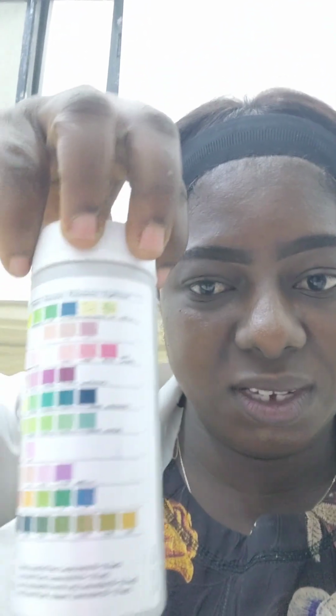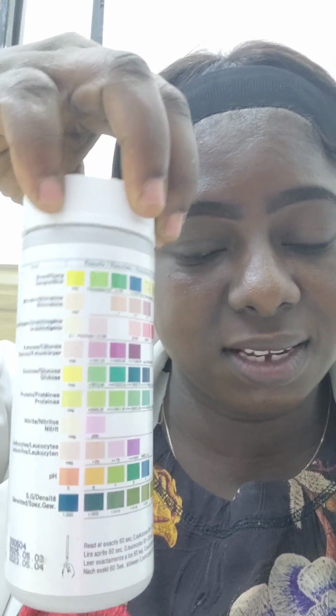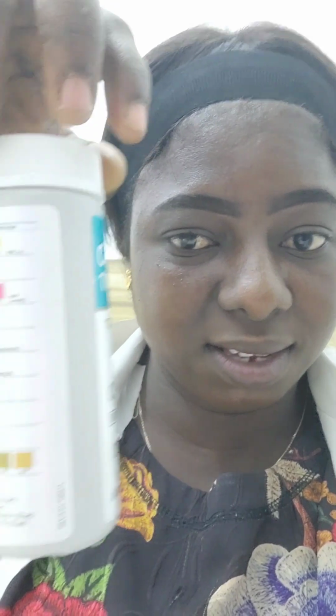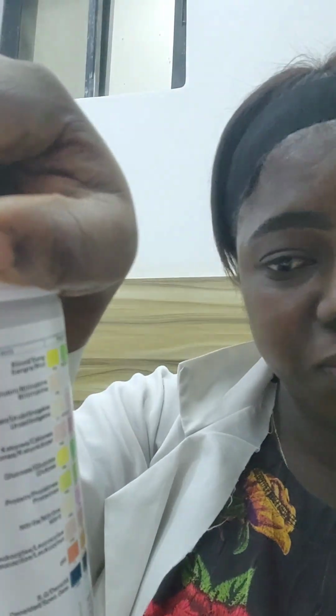This is one of the test kits that we use for the urine analysis test. It will show you whether the urine has blood, bilirubin, glucose, protein, or nitrite, positive or negative.